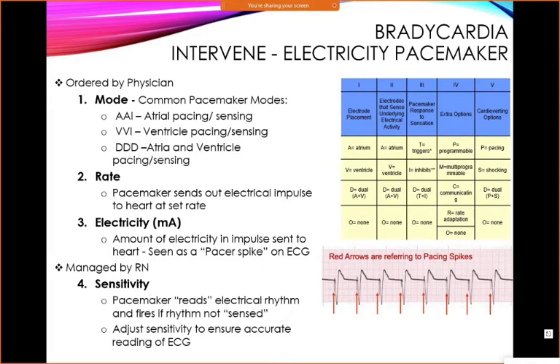So don't worry about inhibits versus triggers. All pacemakers are inhibitory unless they're on some kind of timer and they're waiting to see if the ventricle does. It's basically giving the chance for a ventricle to work. That starts to get really complicated, and like I say, trigger is not a very common mode. Inhibit is what pacemakers do.